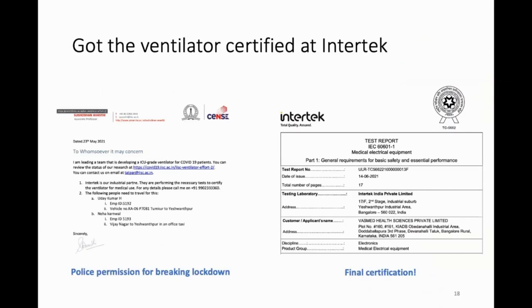We then have to get certification. This is actually the image of the police permission slip that I had to give the guy who actually took the ventilator, because another lockdown was going on. But we finally got the initial performance specification, third-party certification that the ventilator actually worked.